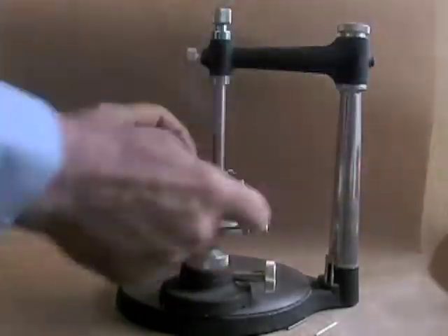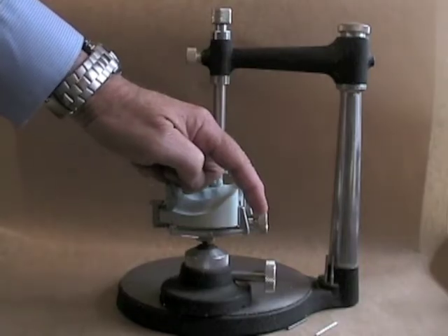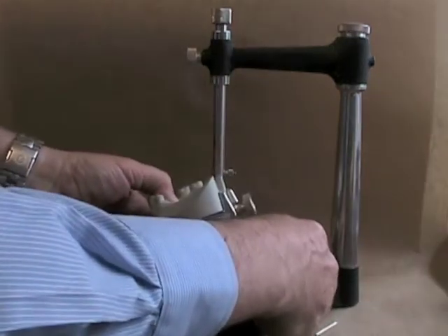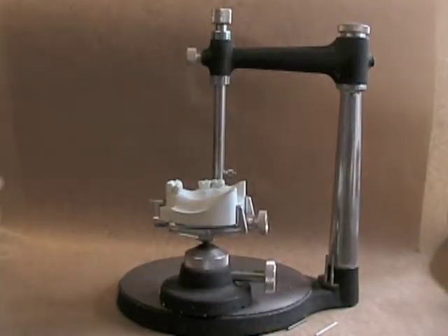The top knob is used for fixing the cast to the cast holder. The bottom one is for changing the tilt or the path of insertion of the arch or the cast that you're using.